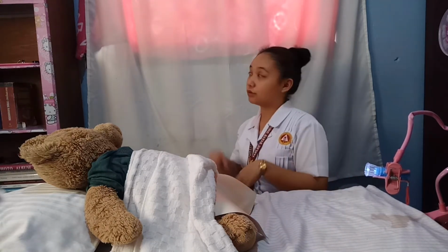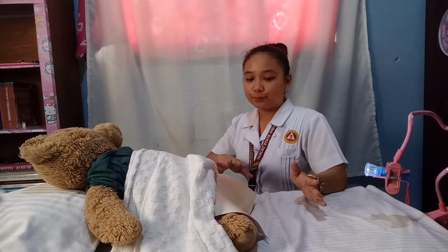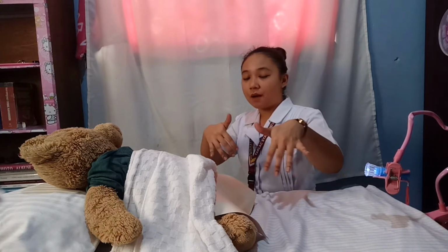Then you need to provide privacy for your patient or client. If you're in a room, make sure that you close the door and the window, and if there's a curtain, close the curtain. Then you need to position your client. If your patient is female, assist her in a dorsal recumbent position with the knees slightly flexed and the feet about 2 feet apart.